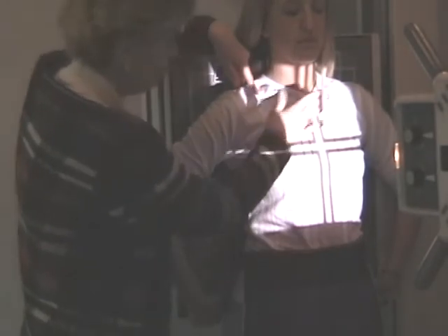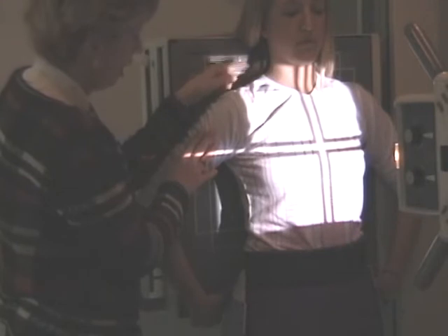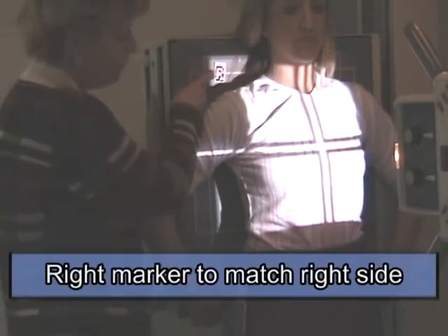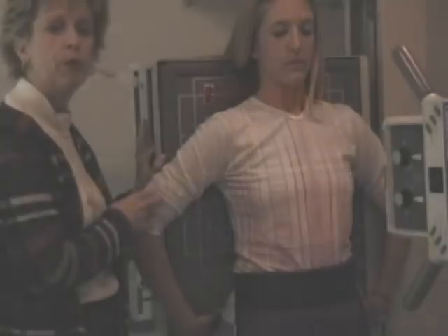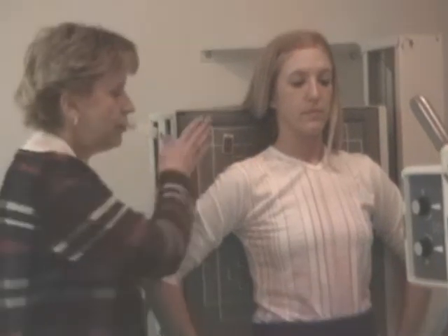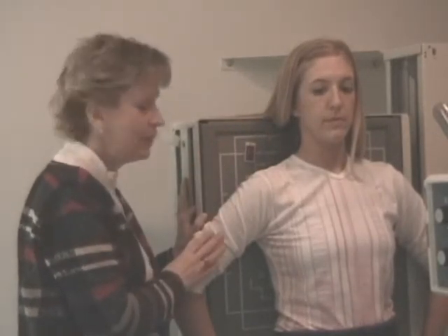AP though, mid-sagittal plane to the center of the film, make sure the patient's straight. The edge of the film, the top edge, is going to be 2 inches above the shoulder at the apical area. And I have a right marker on to match the right side. Now you might ask, why am I doing this in an AP position? This particular scenario is set up for posterior rib injuries. She's injured on the posterior aspect, and we want to get those ribs closer to the film. So this is what we've set up now.